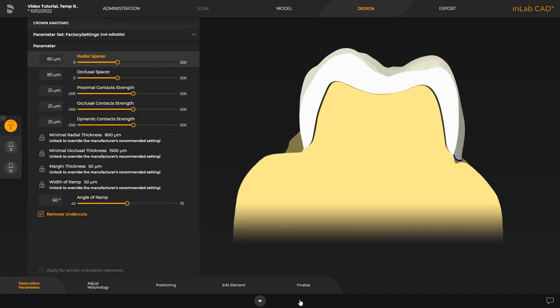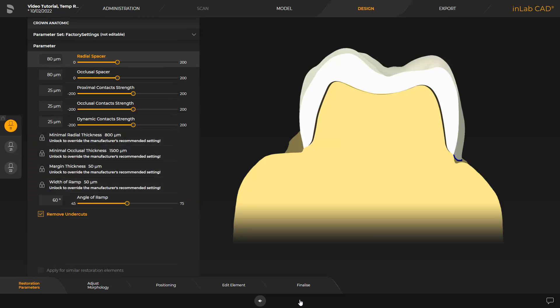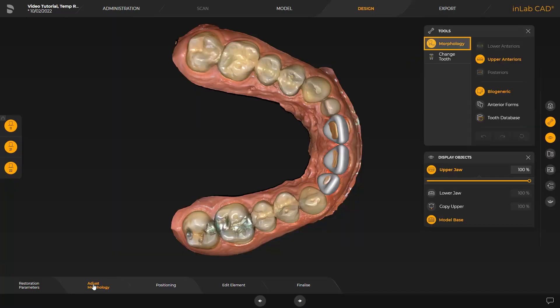If necessary, further adjustments can be made in the Restoration Parameter step. Parameters marked with a lock indicate manufacturer presets, which you can modify at your own risk. Now we move to the Adjust Morphology step. The Morphology tool lets you specify the shape of the front teeth. With the Change Tooth tool, you can modify the shape of individual teeth. We make no modifications and move on directly to the next step, Positioning.